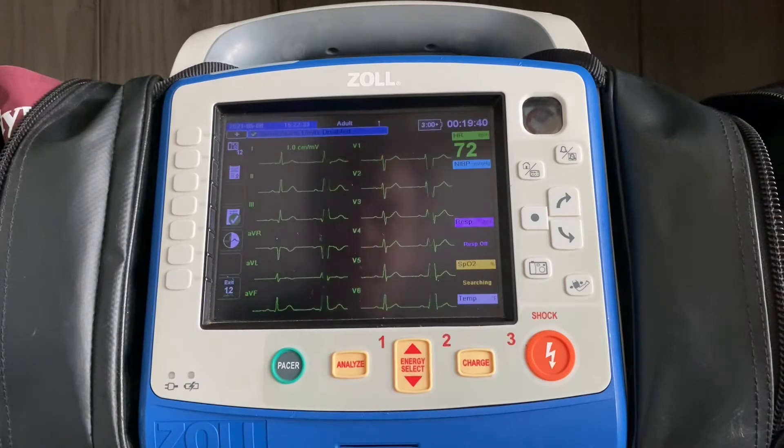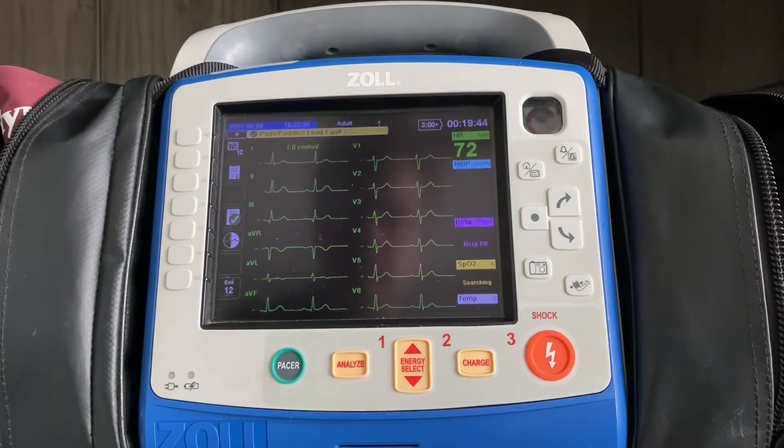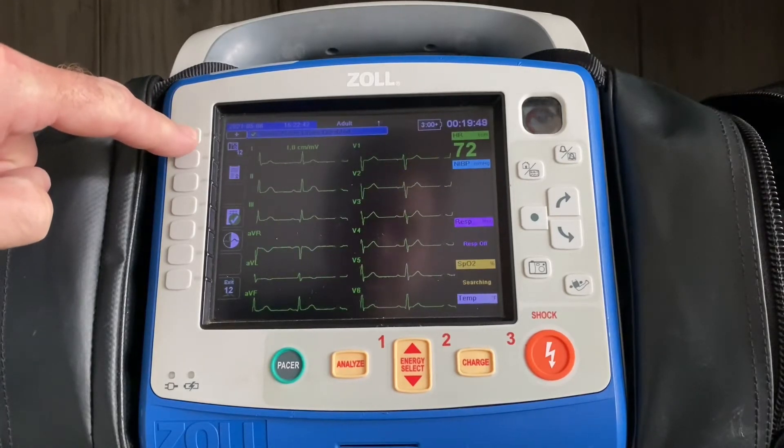Assuming all your leads are placed properly, the common theme throughout this process is that you're going to take a picture of the patient's heart. There's a camera with the number 12 in the upper left corner — press that button.